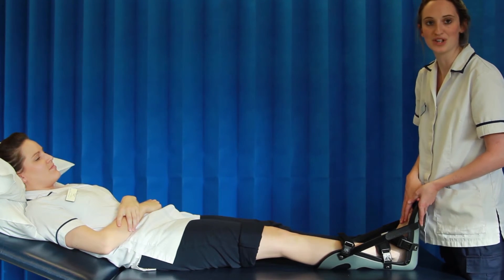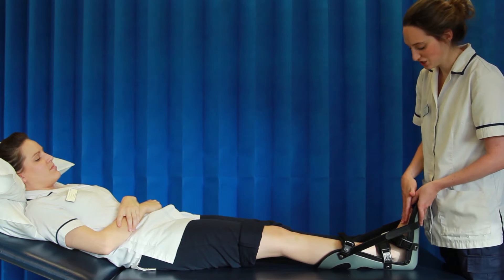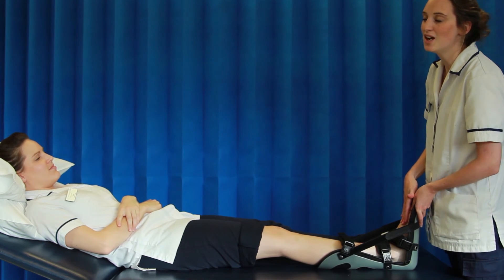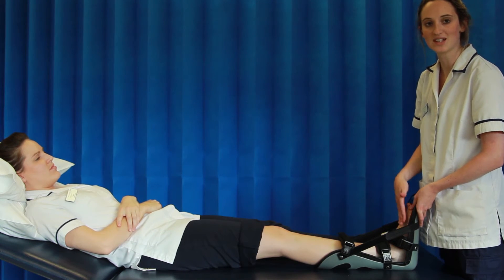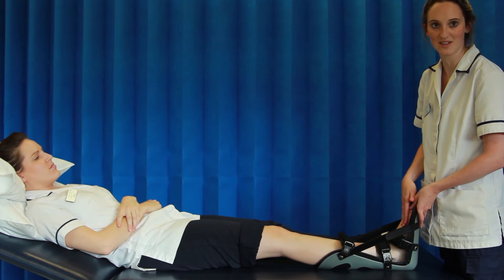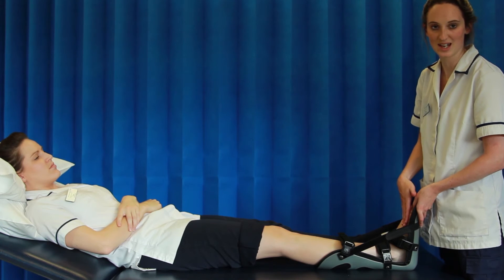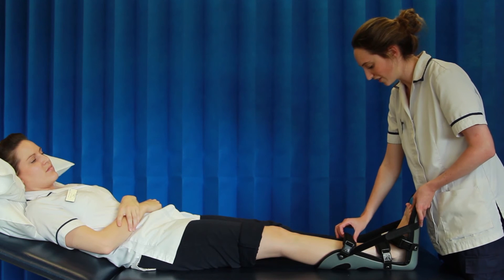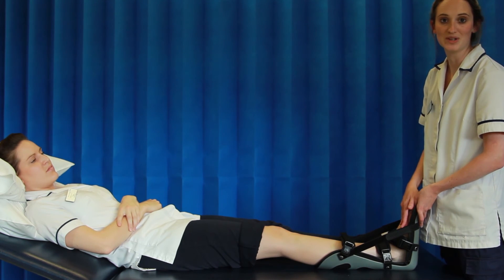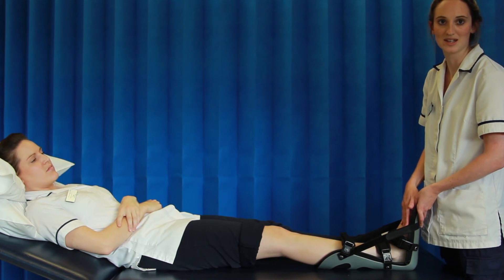This is the optimal position for a UFO splint. You must check for marking, and normally we tend to say leave the splint on for an hour first and four hours off. This time can be built up by your physiotherapist as required and as is safe for the patient. If you notice any red areas or any marks that the splint may have caused, please stop using the splint and consult your physiotherapist.